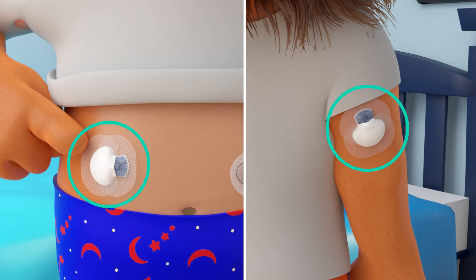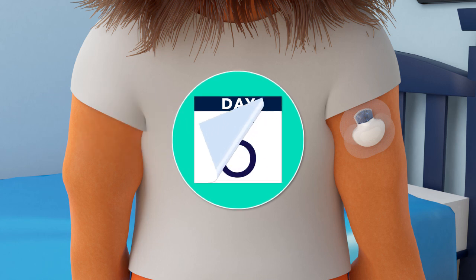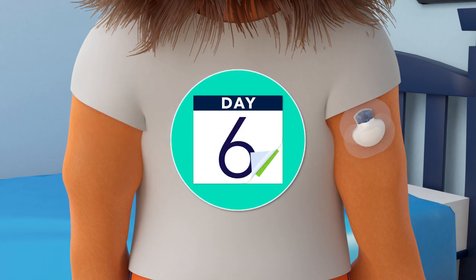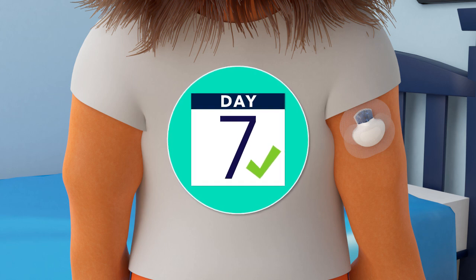That is so cool! Lenny's sensor lasts for seven days. Yours may be different, and that's okay. The important thing to remember is to change your sensor when the time is up, and it's best to do it in the morning.